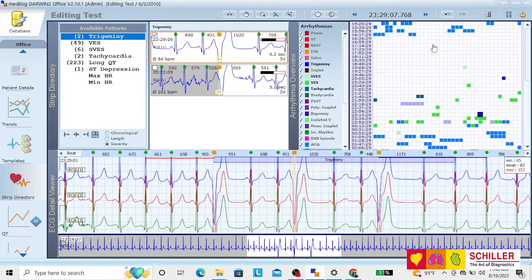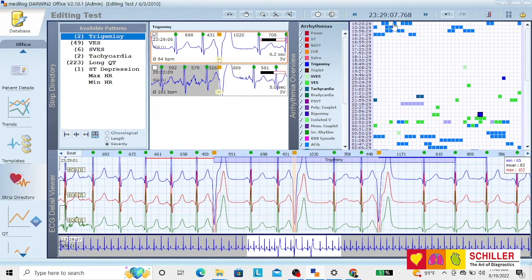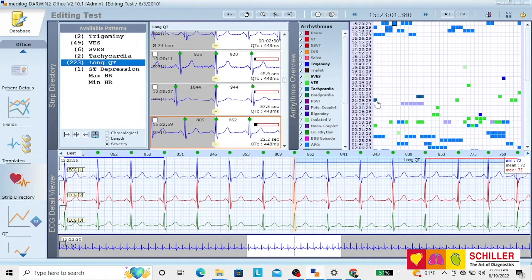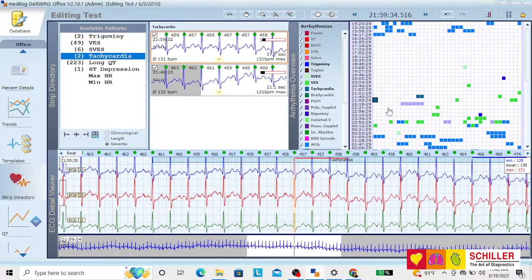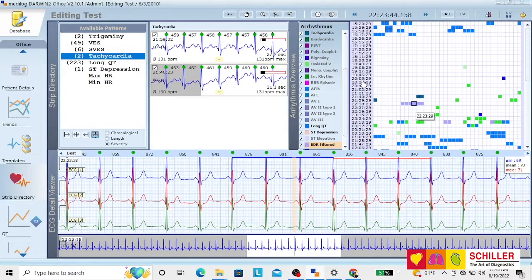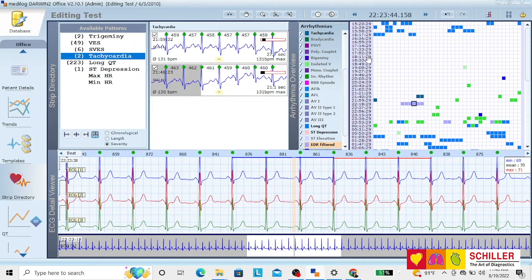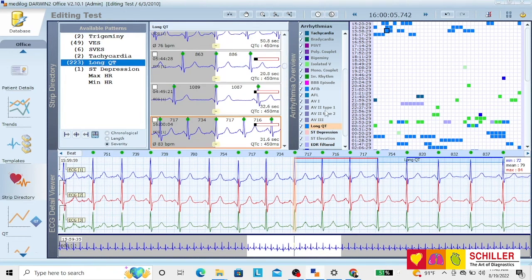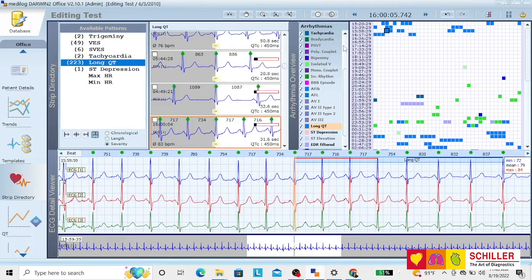On the right side of the screen, what you have is the different events and how they happen on time. So you have all the times and the different things that you can find directly here. For example, this is long QT. It highlights and it gives you the time.